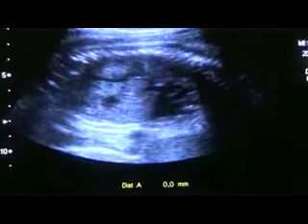Showing no anomaly at 25 weeks gestational age. Normal orbits. Face is normal. No evidence of cleft palate. The cord and the vertebral column are normal. No anomaly seen relating to the vertebral column. The heart is normal — this is the heart. Stomach bubble is visible.